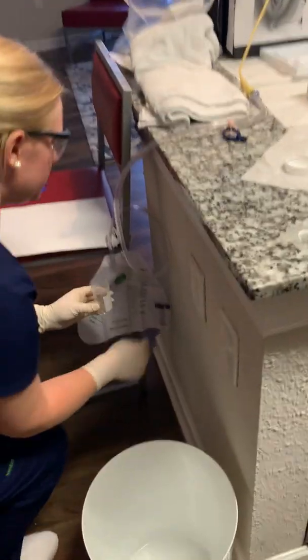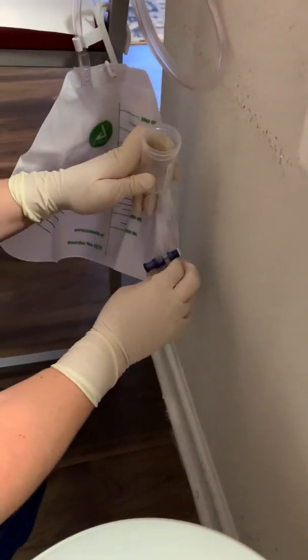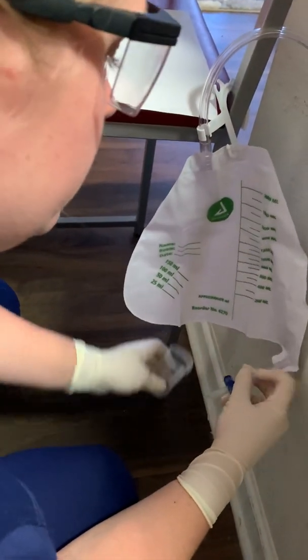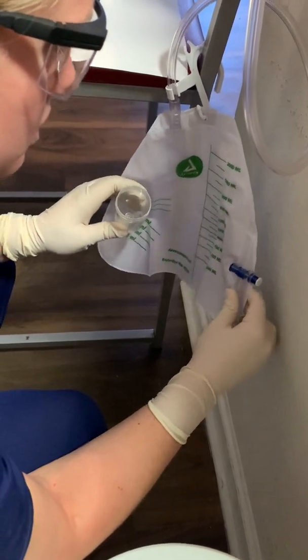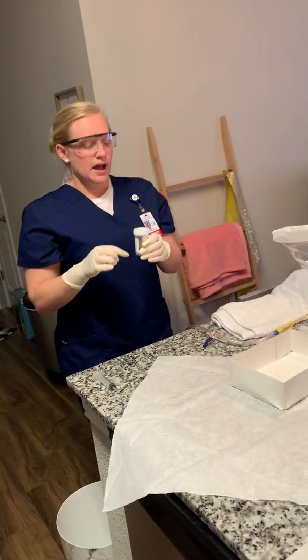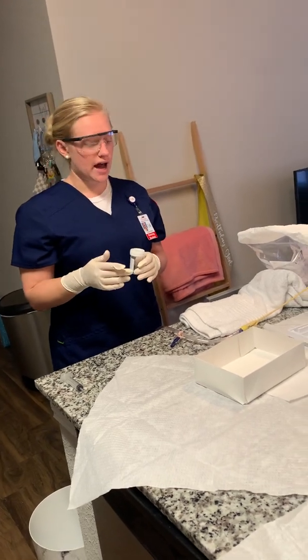So I'm going to come down here, undo the bag, and then I would just put some in, making sure not to touch the outer rim of the cap, and then put it back in, and then I would close it, label it, and send it to the lab.